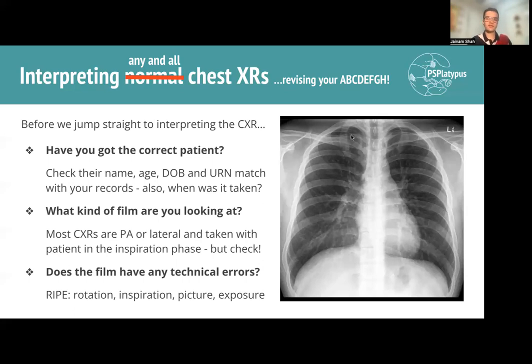Generally speaking, just in terms of rough numbers, when you're checking for inspiratory effort, you should be able to see about 5 to 6 ribs on the anterior side, when you count them from the top, meaning the apex, to the bottom, where it kind of stops at the diaphragm level. And if you're looking at the posterior ribs, then probably about 8 to 9, at a stretch maybe 10, but 8 to 9 is generally the accepted number of ribs to count.